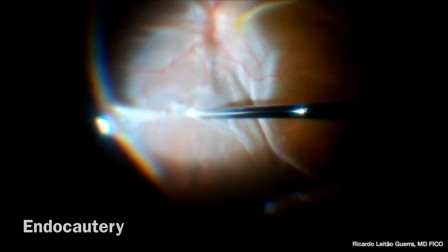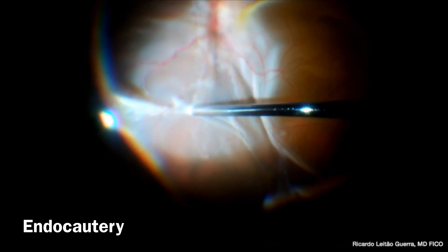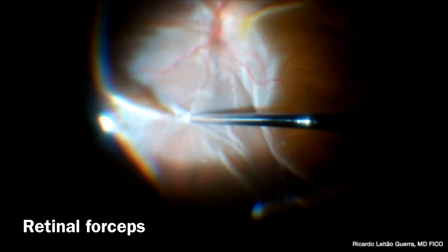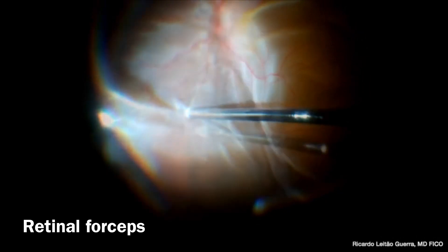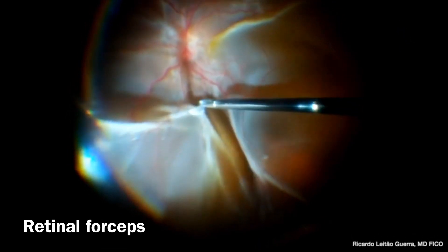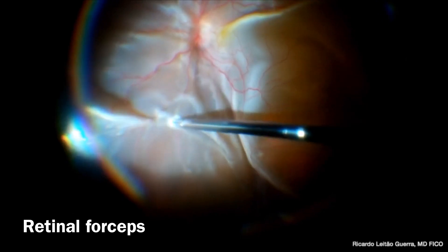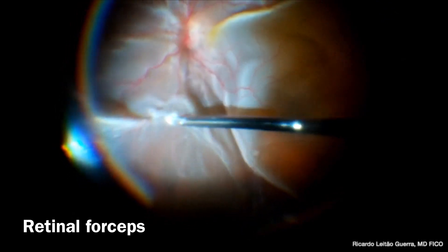To remove it, first use an endocautery, and then a small retinotomy is made over the subretinal band. Then you can use a retinal forceps to pull it out through the retinotomy.